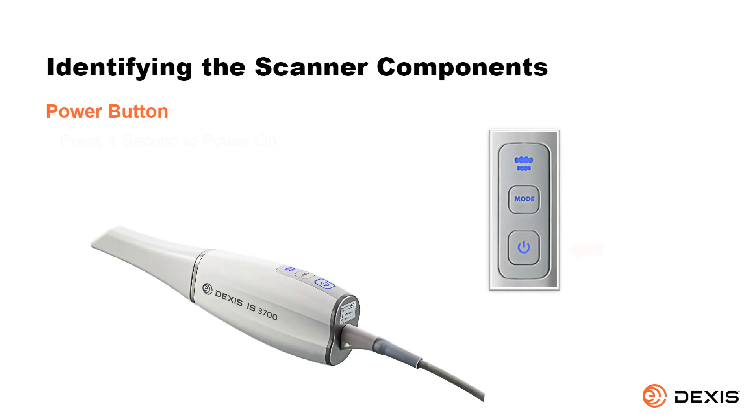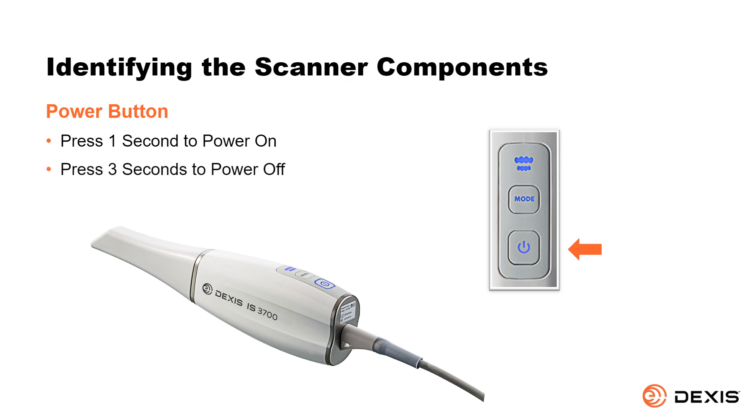Power button. Press one second to power on, and three seconds to power off.